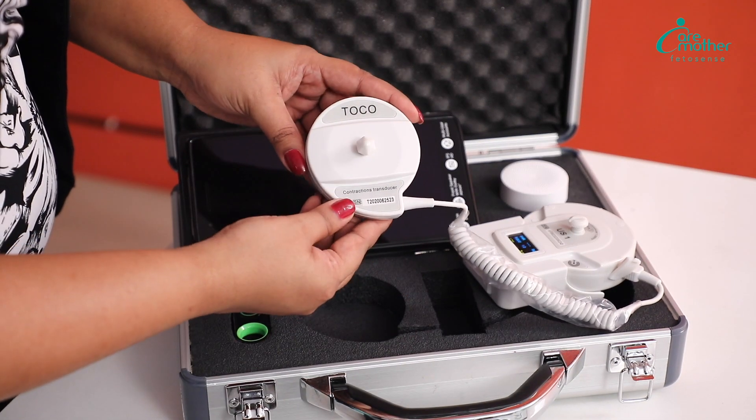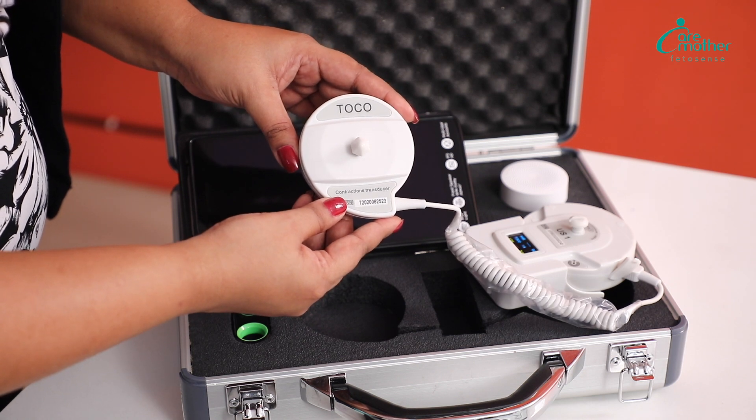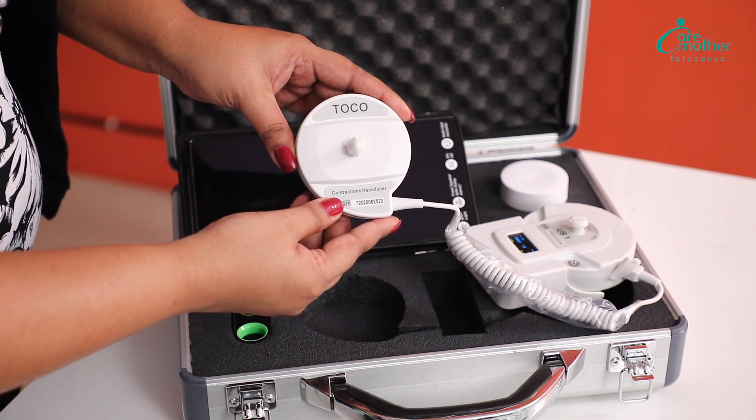The next probe in the kit is the TOCO probe. This is used for contraction monitoring or labor monitoring.